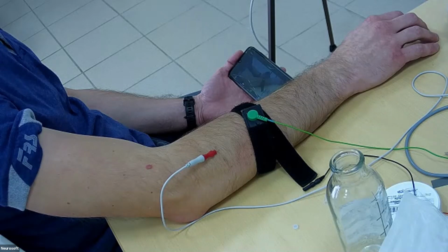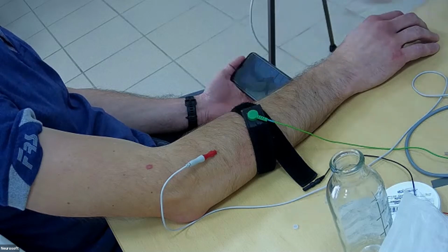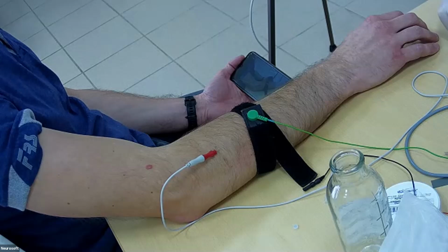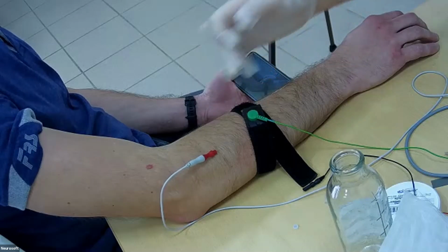Macro EMG we will register with a concentric needle. We will use two-channel macro EMG registration. One channel will be the concentric needle, as usual.